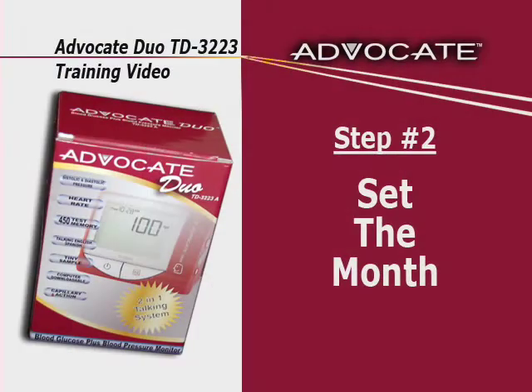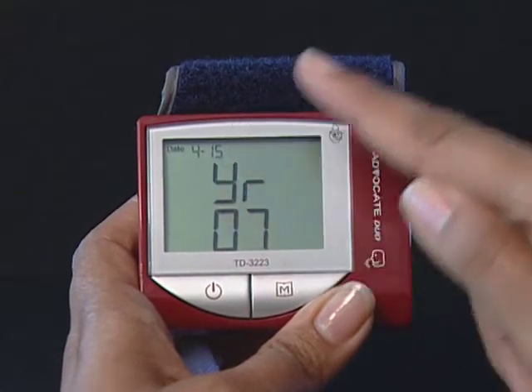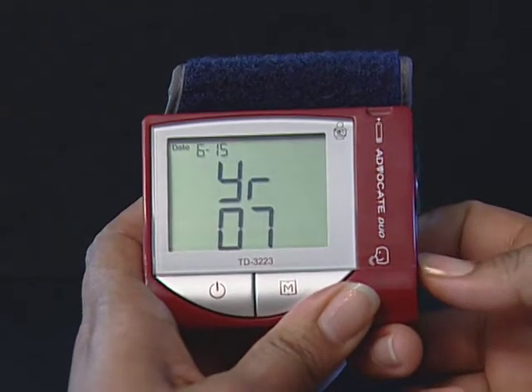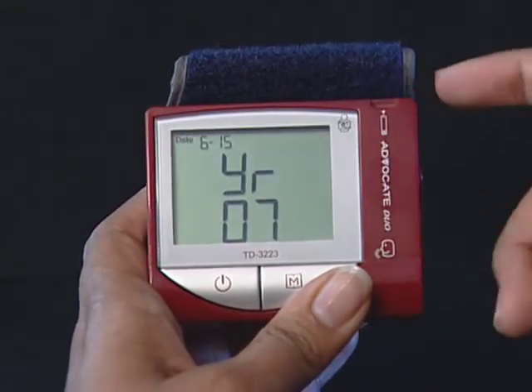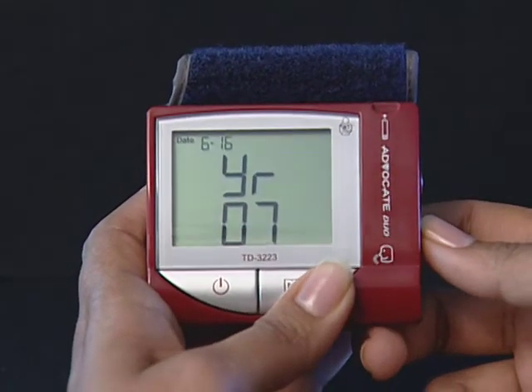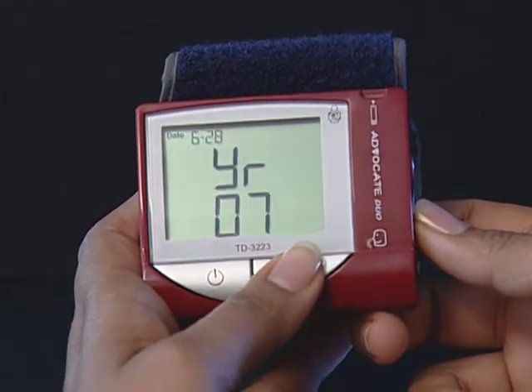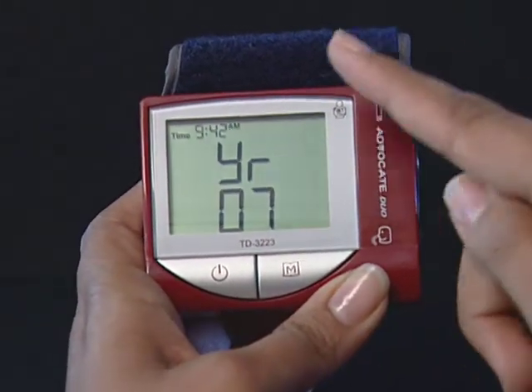Step 2: Set the month. Press and release the M button until the correct month appears. To move faster, hold the M button down. With the correct month on the display, press the set button and then the day segment flashes. Set the day. Press and release the M button until the correct day appears. To move faster, hold the M button down. With the correct day on the display, press the set button and then the hour segment flashes.